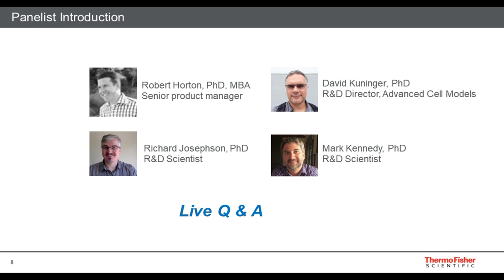Great. All right. A couple of questions here about what ECMs we have used and been successful with, especially for organoids. Well, primarily we've used the Geltrex for encapsulation of spheroids or organoids, and had pretty good success with that.